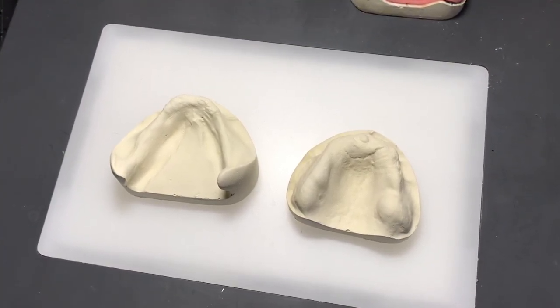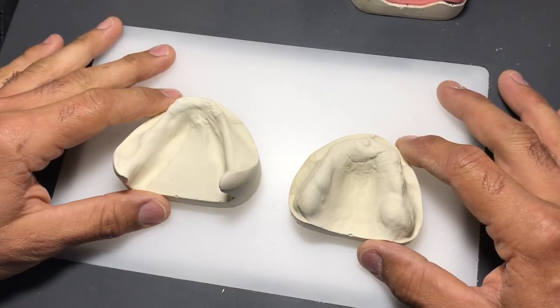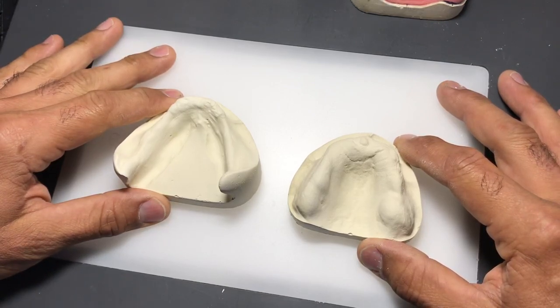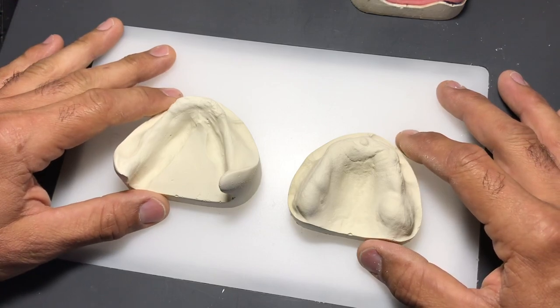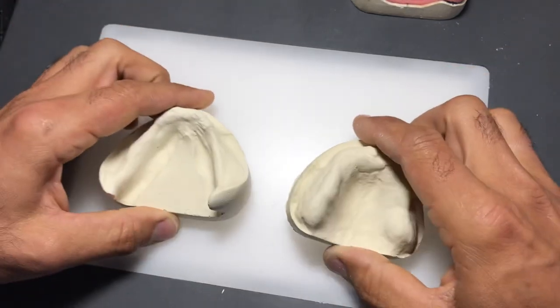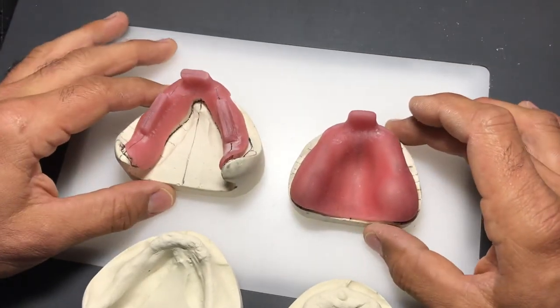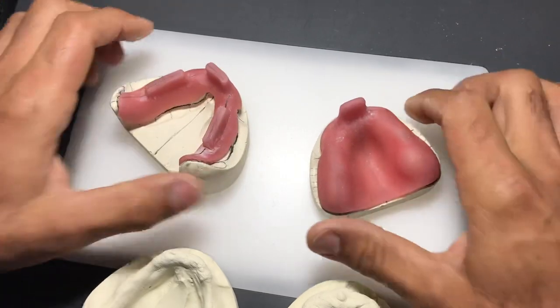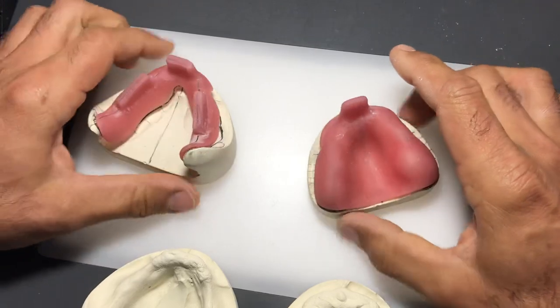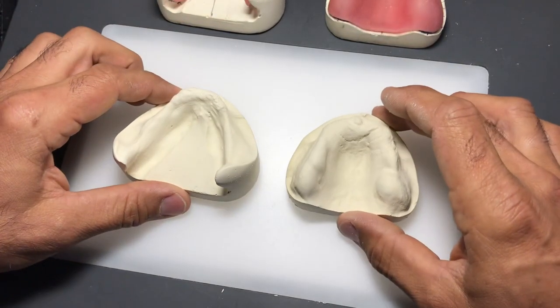We have an upper and lower model - maxillary and mandibular cast. The words 'model' and 'cast' are synonymous in our industry. These are achieved by the preliminary impressions you get with your client at the first appointment. Once we pour and trim the cast, they should have a symmetrical-looking base and be easy to handle. The goal is to fabricate upper and lower custom trays - trays made from resin used to achieve a functional impression at the next clinical appointment.